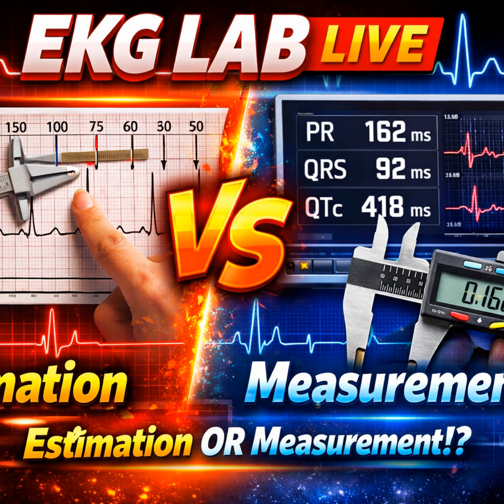I understand the appeal of speed, and I certainly respect the intuition of an expert. But let me give you a different perspective on what expertise actually is. Accuracy is the bedrock of medicine. On a standard EKG strip, the horizontal axis represents time. This is a fundamental law. It is immutable. To navigate this law, we have standard dimensions. A small box is exactly 0.04 seconds, or 40 milliseconds. A large box, which is composed of 5 small ones, is 0.20 seconds, or 200 milliseconds.